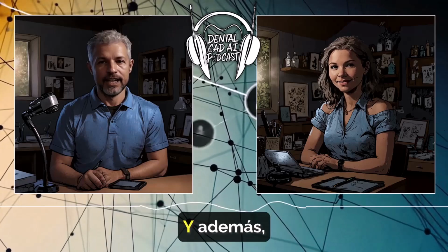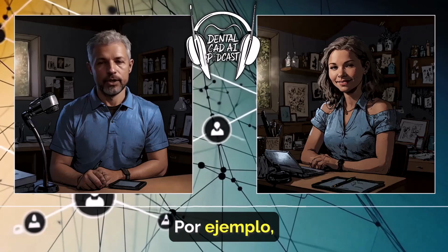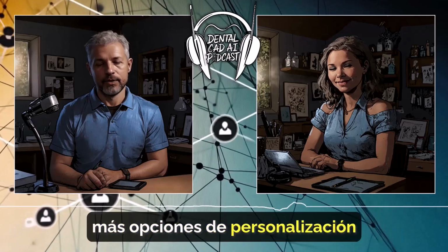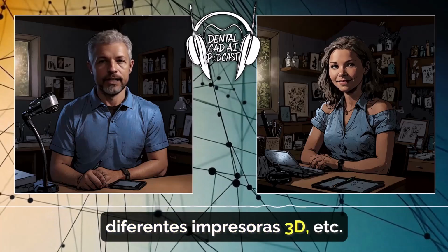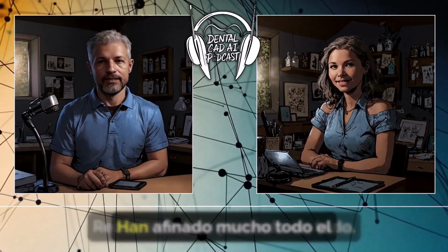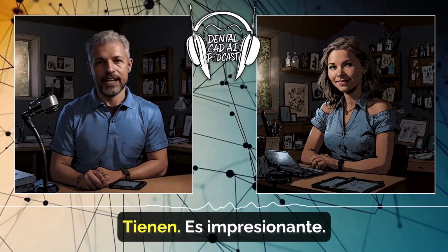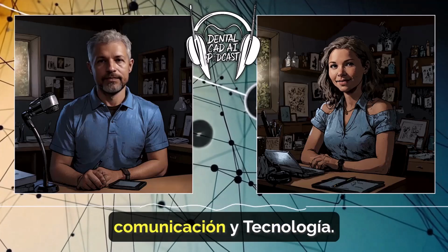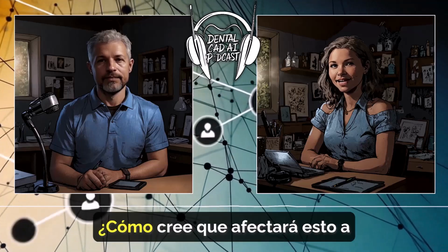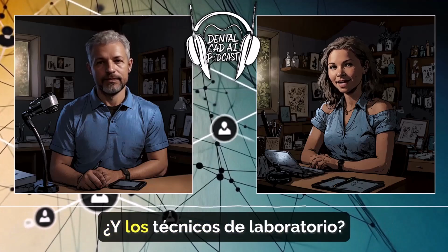For sure. And beyond that, there are tons of smaller improvements in the model creator too. Like what? More customization options for individual dies, better support for different 3D printers, you name it. They've really thought of everything. They've really fine-tuned the whole model creation process, haven't they? They have. It's impressive. It makes me wonder, with all these advancements in communication and technology, how do you see this impacting the relationship between dentists and lab technicians?